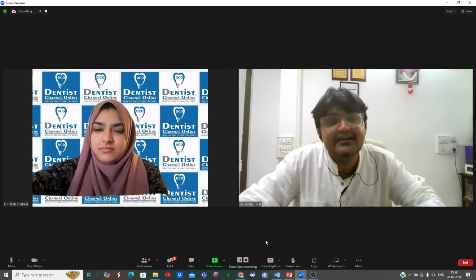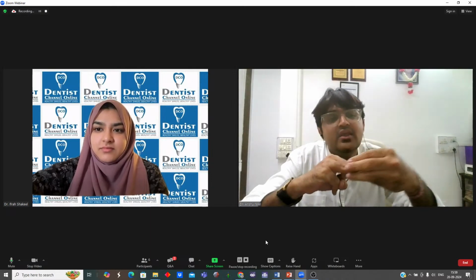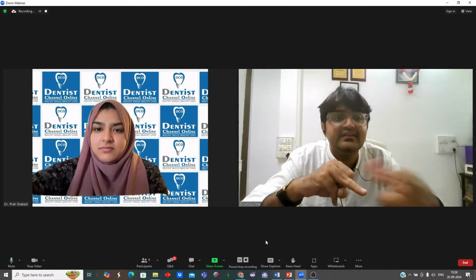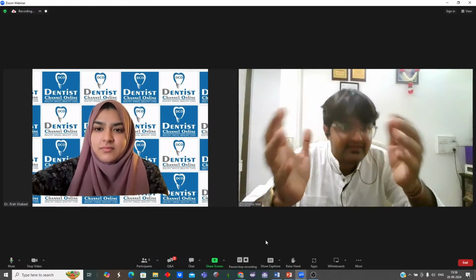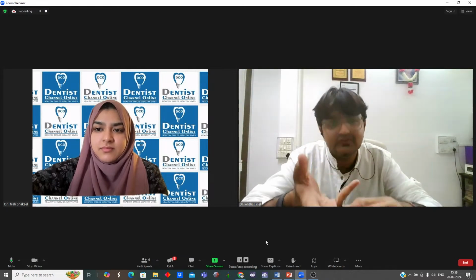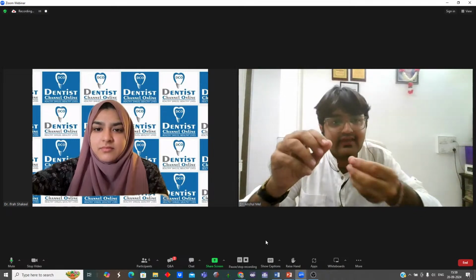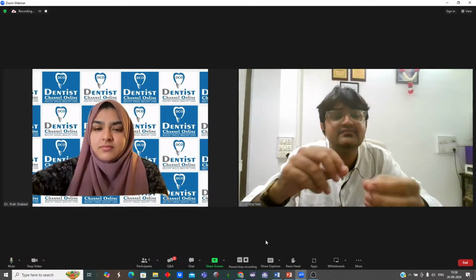Okay. So first condition, you want to extract the tooth and you want to place the implant. So you can use immediate temporization, as I showed in one case in which we had a partial extraction, we placed the implant and we got the complete profiling of that. In that also, if the coronal part of the tooth is intact, then you can use the coronal part as a crown. You can make an abutment along with that. There is one technique.